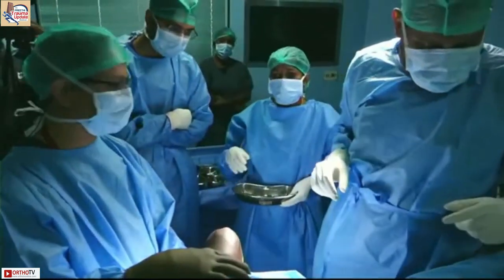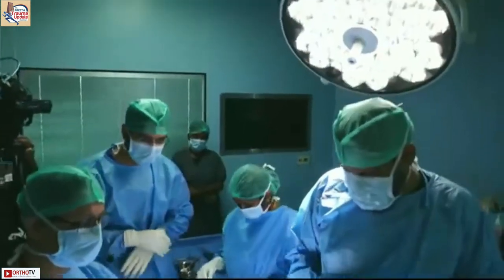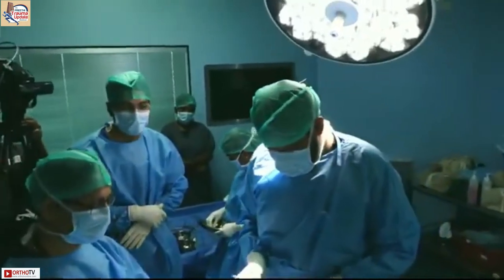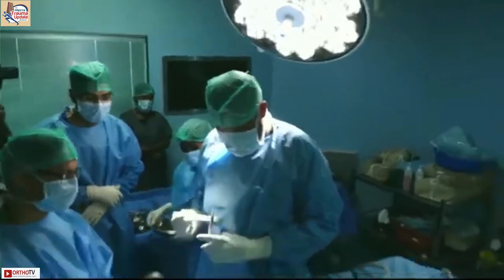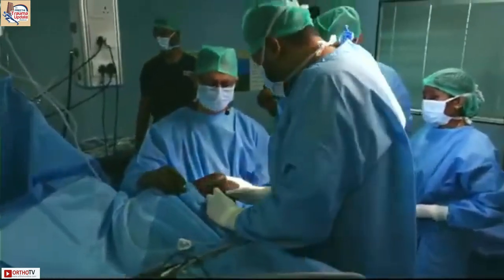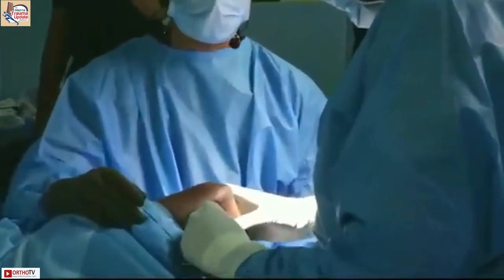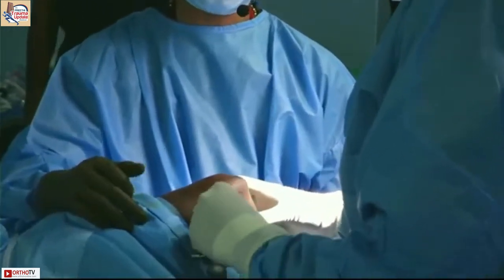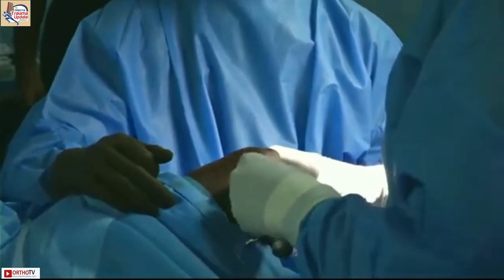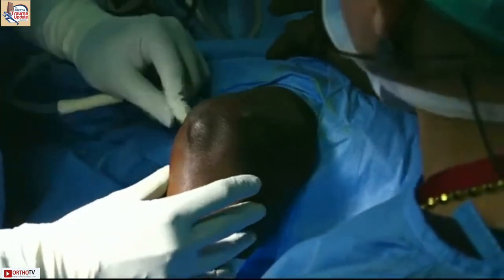And then the trocar. So don't you look for the ulnar nerve? So we mark the ulnar nerve and it is always dorsal or posterior to the medial epicondyle. And the portal is anterior to the medial epicondyle. So we normally suggest that you put your finger and palpate rather than relying on the surface marking. When you palpate and then you can mark, when you put the portal, you will hit the medial ridge. When you hit the medial ridge, you have to make sure you don't go dorsal to it, you go ventral to it.